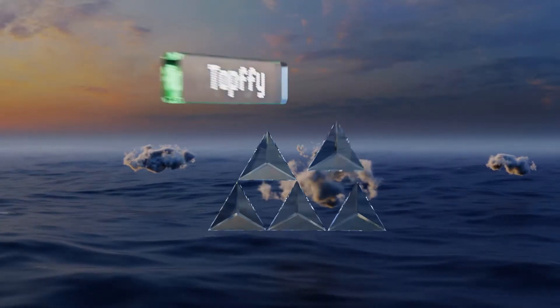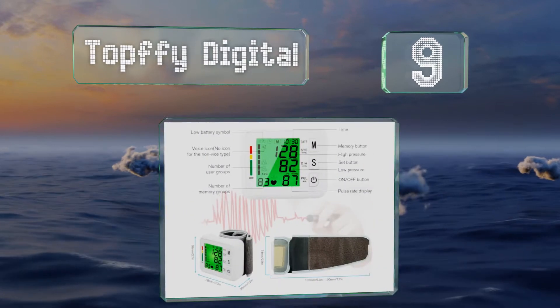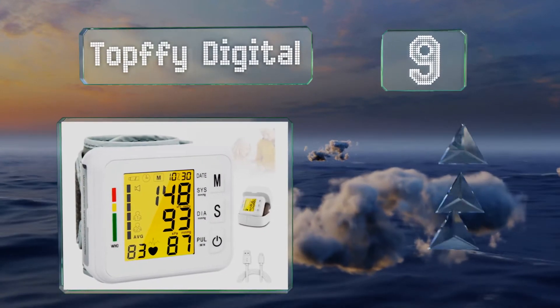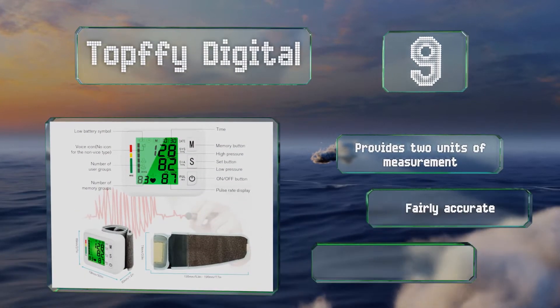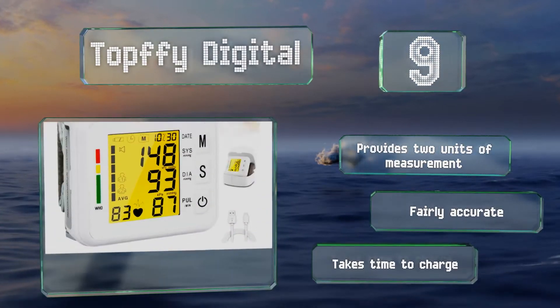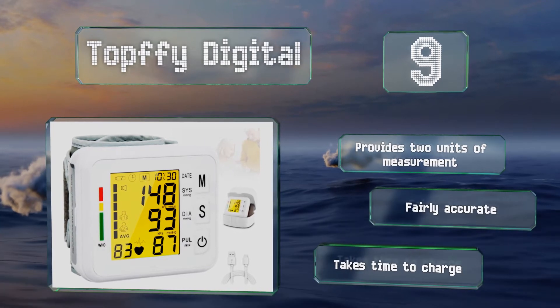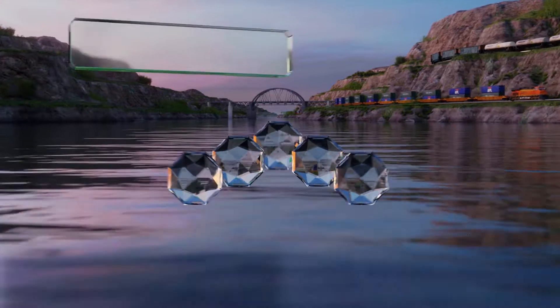Starting off our list at number nine, the Topffy Digital features an easy-to-read display that changes color based on the range your pressure falls into. It's compact and straightforward to use, and while it doesn't come with an app for tracking data, it can store the most recent 99 readings for up to two users. It provides two units of measurement and is fairly accurate, but it takes time to charge.